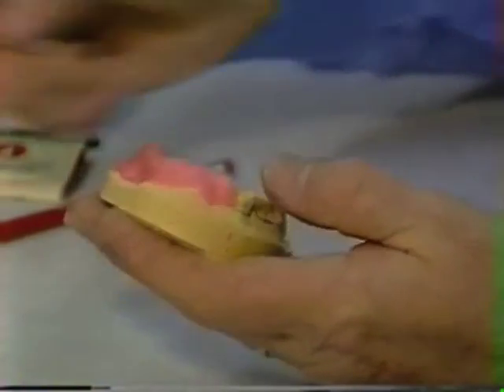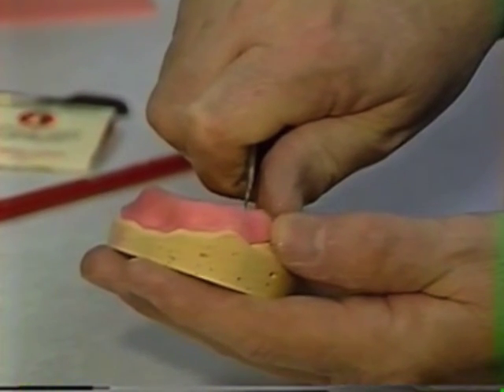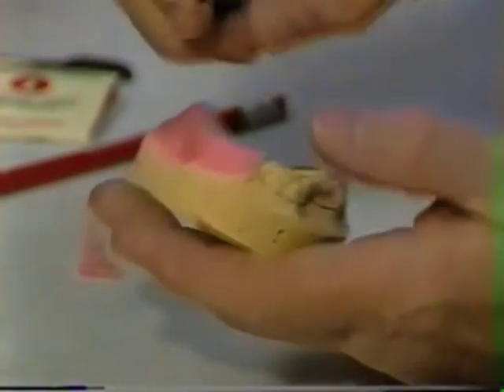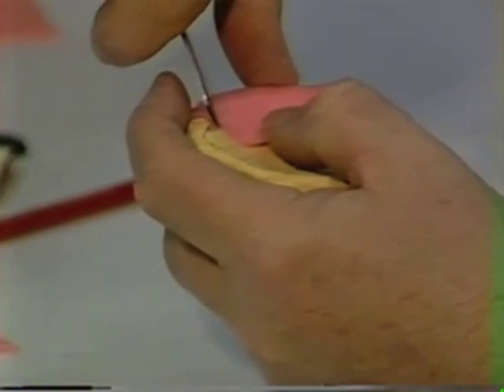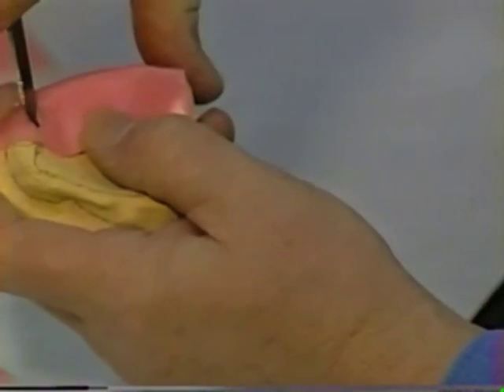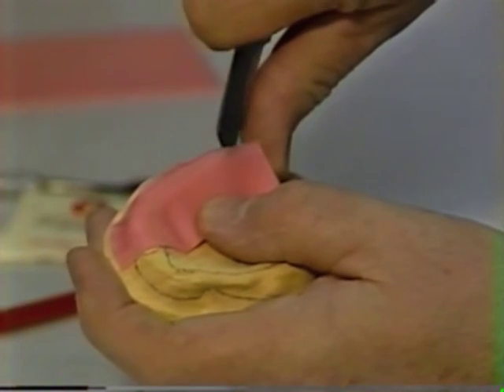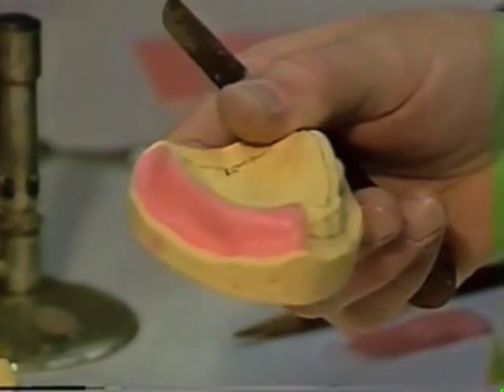So I'm going to form a junction area for the first layer of wax I put on here for the one side, so that when I place the other side on it, I'll have a nice smooth junction of the wax there. Then I'm going to warm a knife and cut right to the line, which you can see on here, at the crest of the ridge, cut the wax off, get rid of what's on the palate, and adapt it in real well. And now our relief is complete for the one side. That's all the relief you need, just the 1 layer of base plate wax.